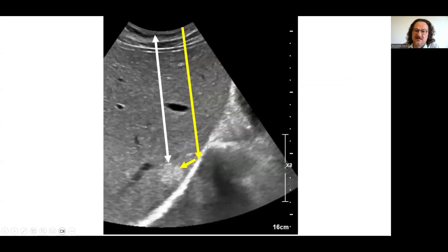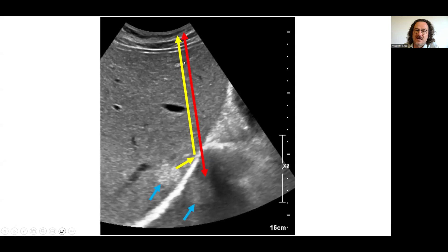Here you can see the mirror artifact at the diaphragm interface. The hemangioma is visible in its original location, but the reflected image goes back deeper than the original — a mirror image of the original appearing in an incorrect, deeper location.